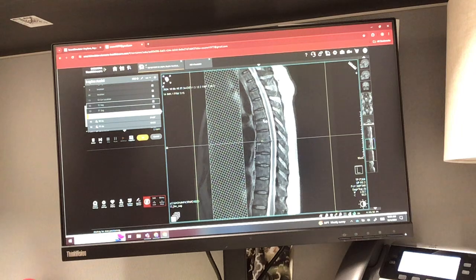These are your individual intervertebral disc spaces. So if this is T12 and this is T11, this would be the T11-12 intervertebral disc space right here. Okay, the middle part of it that's nice and bright, when it's healthy, it should be nice and thick and bright like this. This is your nucleus pulposus, and those outer edges are your annulus fibrosus.